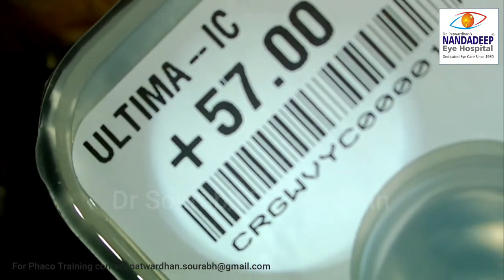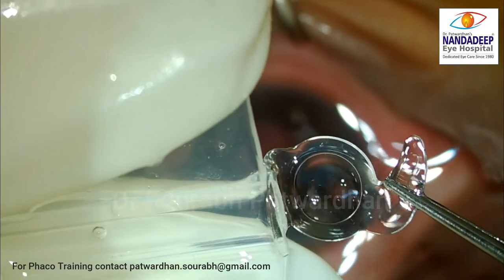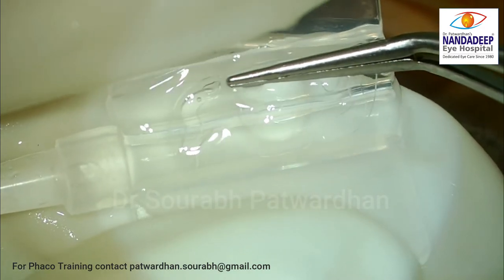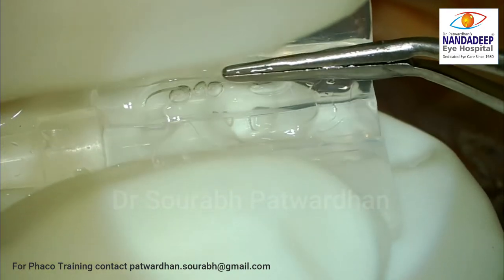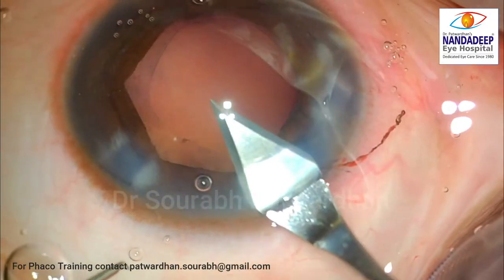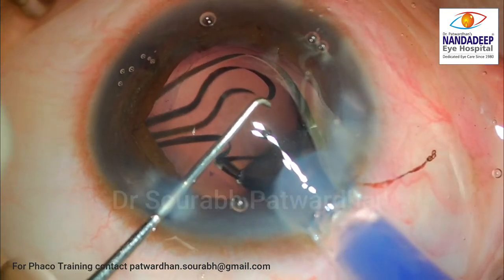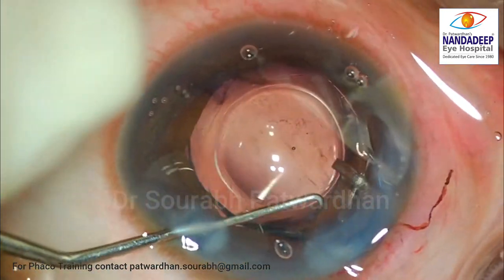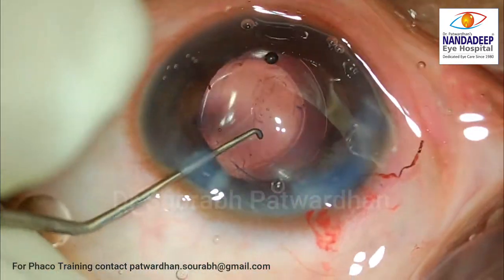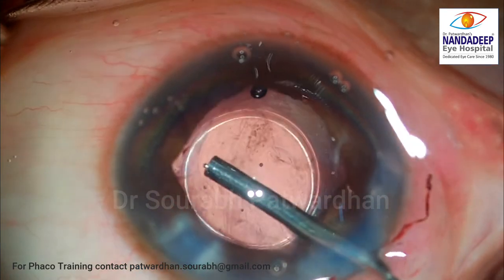This is a customized 57-diopter hydrophilic IOL. I am going to use a larger cartridge for this which goes through 3 mm. It is a kind of lenticular design — there is a central high-power lenticule, and that is done to reduce the overall thickness of the IOL. This is a butterfly-type open cartridge and it's important to make sure that the haptics don't get stuck with the plunger. I have already enlarged the incision to 3 mm and the IOL can be injected very easily. The IOL is placed in the bag, looking very steady and well centered.